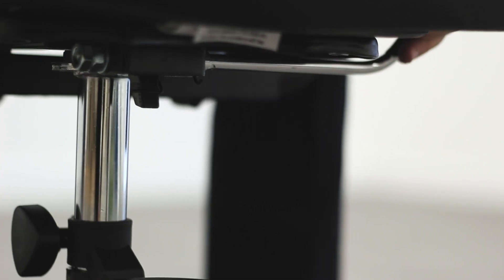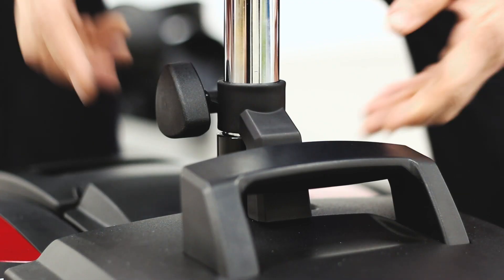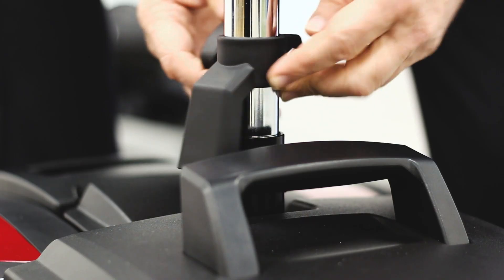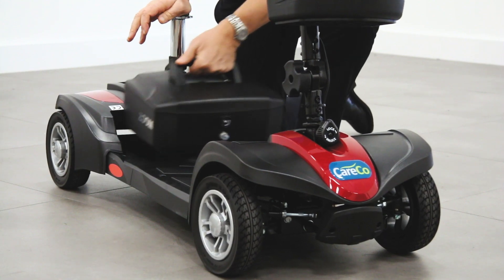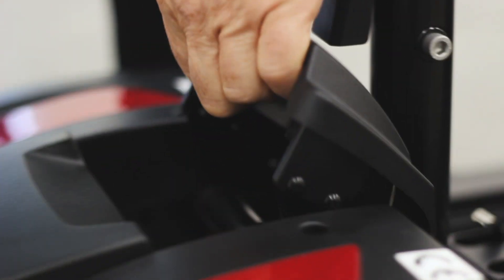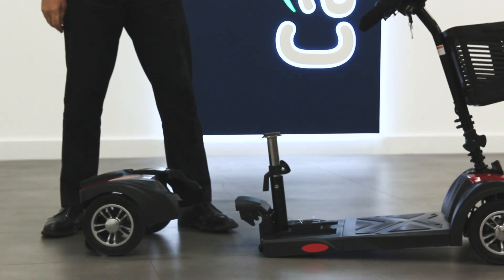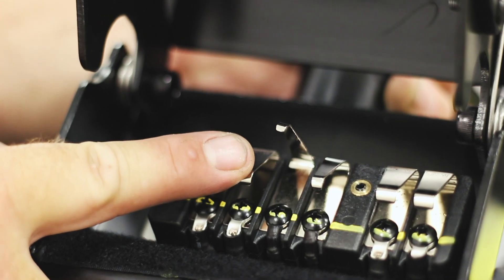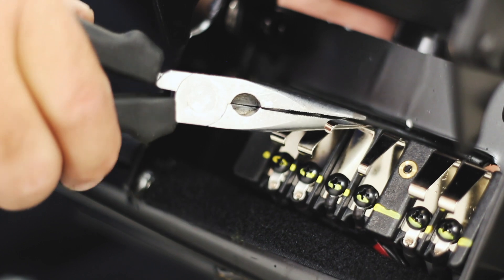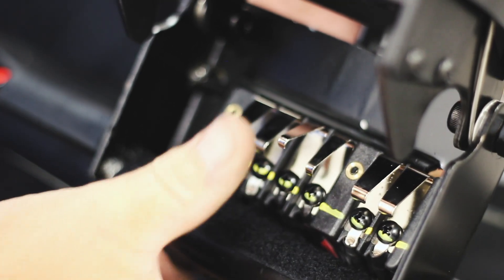To disassemble your travel scooter, first twist and remove the seat from the seat post. Next, loosen the battery lock and rotate it out of the way of the battery. Remove the battery pack using the handle. Lift the base of the scooter by the seat post and pull the rear section away to disconnect the pins. If the pins ever get bent out of shape, simply use a set of pliers to gently ease them back into the correct position.